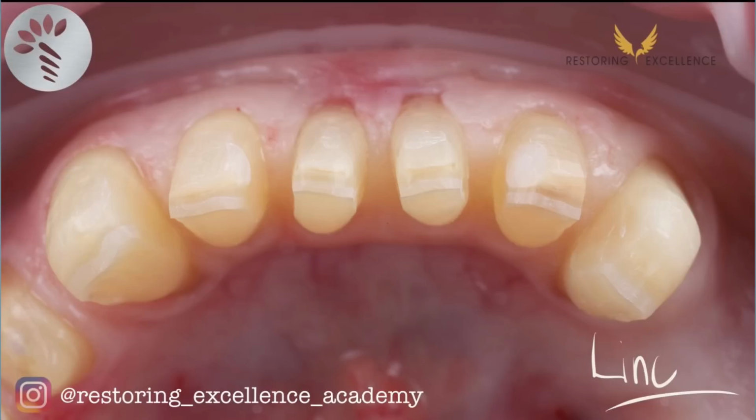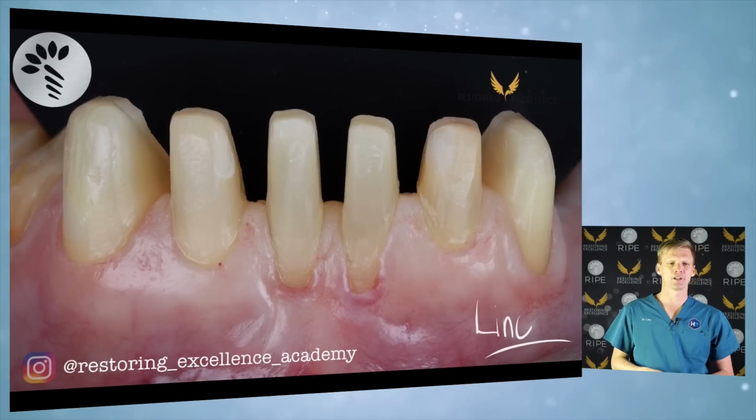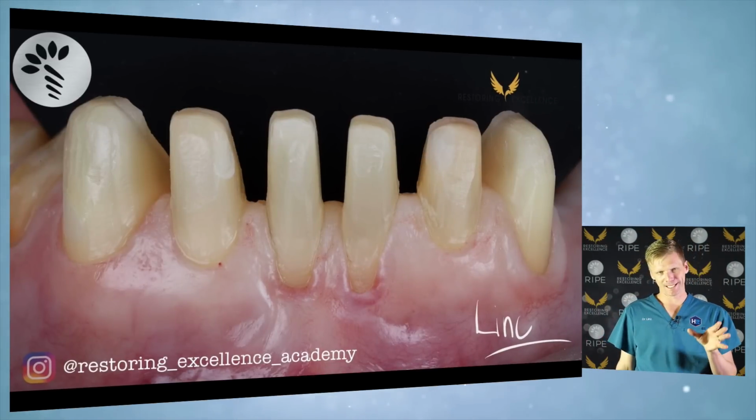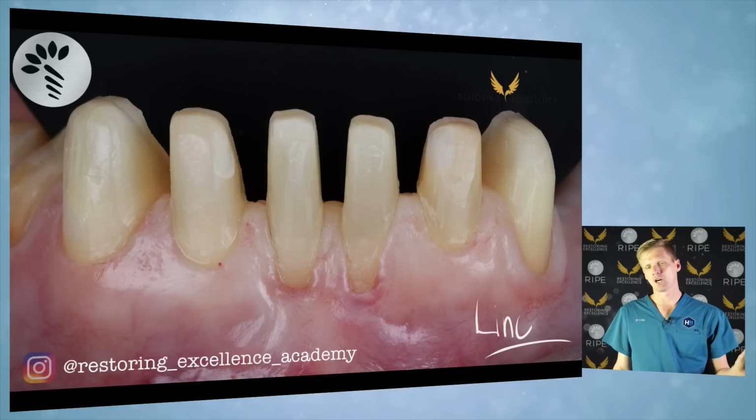Now after I prepped here, I got things as smooth and flowing as I could, and then we polished the teeth. Polished with my usual polishing cups that I use for composites, and you'll have that in the link. I don't necessarily need to have them glossy. Sometimes I'm bored and I'll do them glossy because I know it looks good in photos, but it doesn't have to be glossy, and there's probably some benefit in having them just a little not shiny, okay?